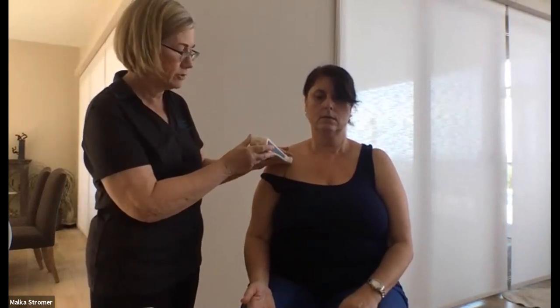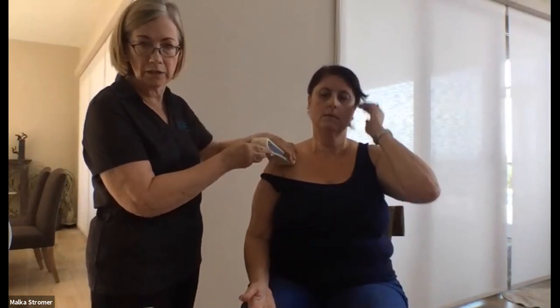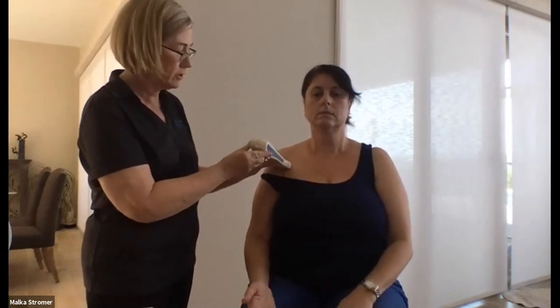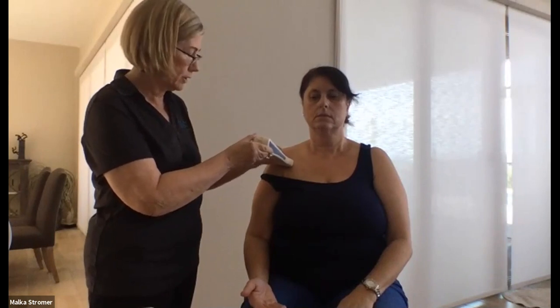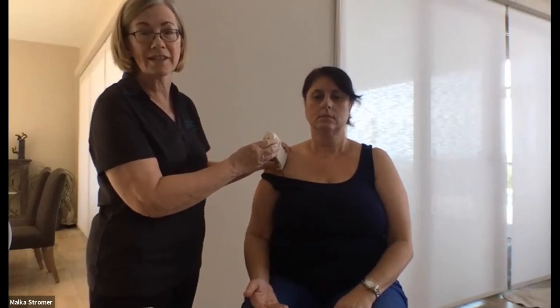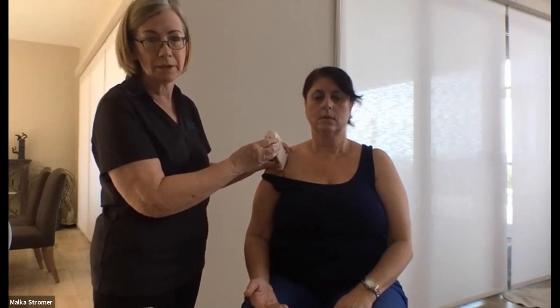So now you can see we've gone from a short axis view into a long axis view. When you're first starting, the better way to do this, instead of looking at the screen and trying to maneuver, is to just figure out where you are. If you've got the best picture here, just look at the transducer and rotate it 90 degrees, and that will get you pretty much where you need to be.